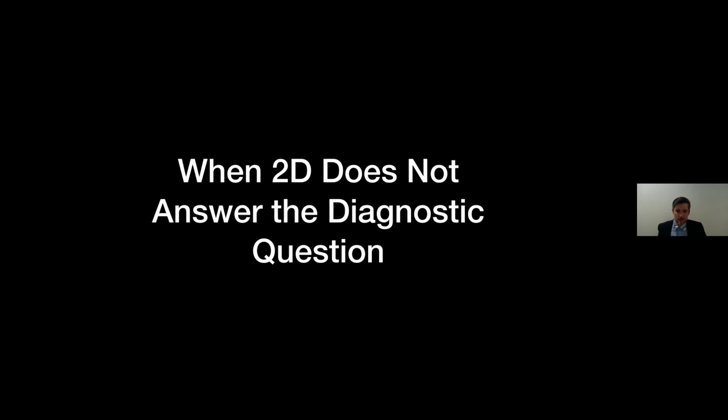And really the best answer is when you as a clinician feel that 2D does not adequately answer the diagnostic question you're trying to answer for your patient. So ultimately, I think you'll find that cone beam really helps with your diagnosis and treatment planning and ultimately leads to better patient care.